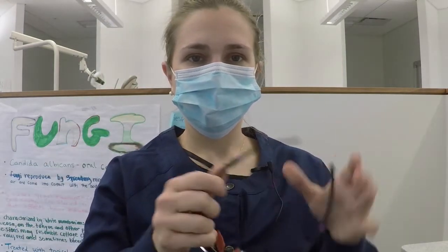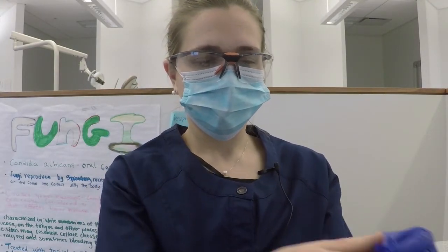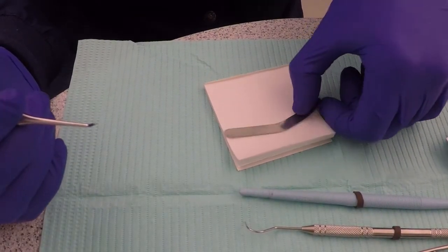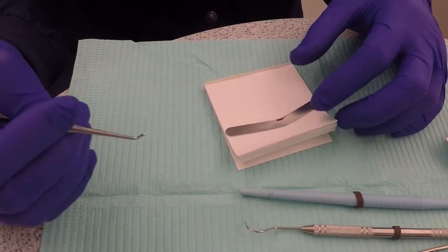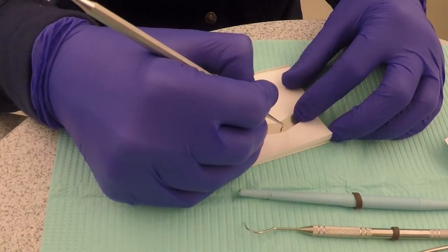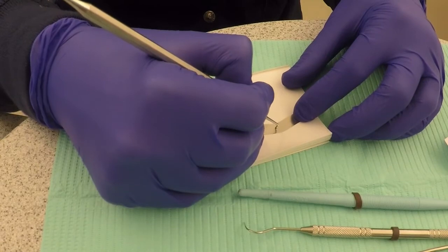Before we begin, we will need to wash our hands and place our PPE. Place the middle of the band on the paper pad and burnish the inner surface of the band with the ball burnisher. Burnishing is done so that the final restoration will have proper contact with the adjacent teeth.